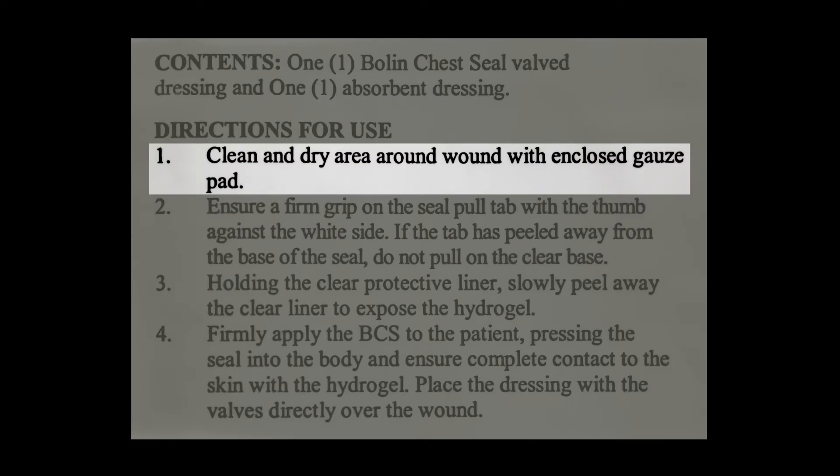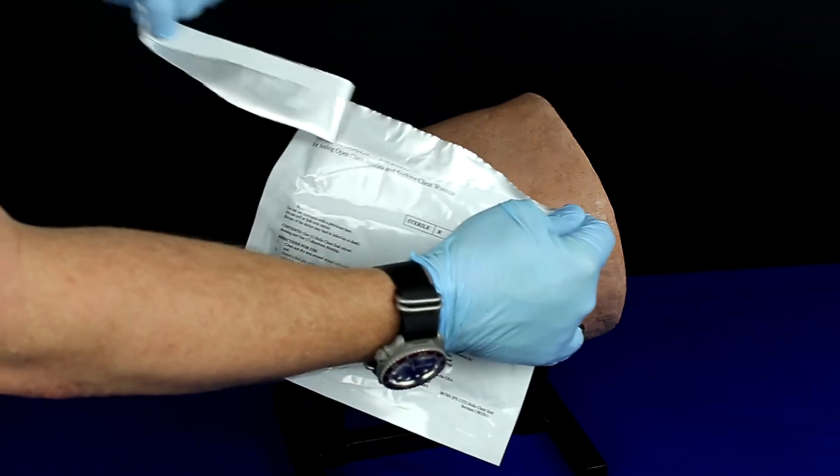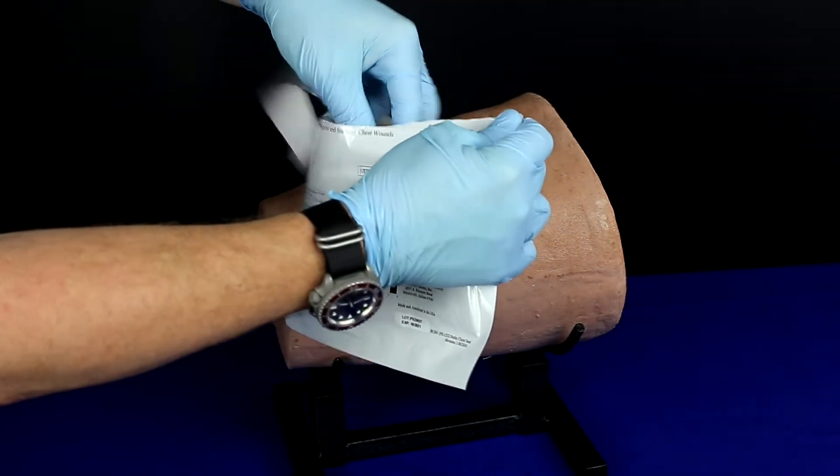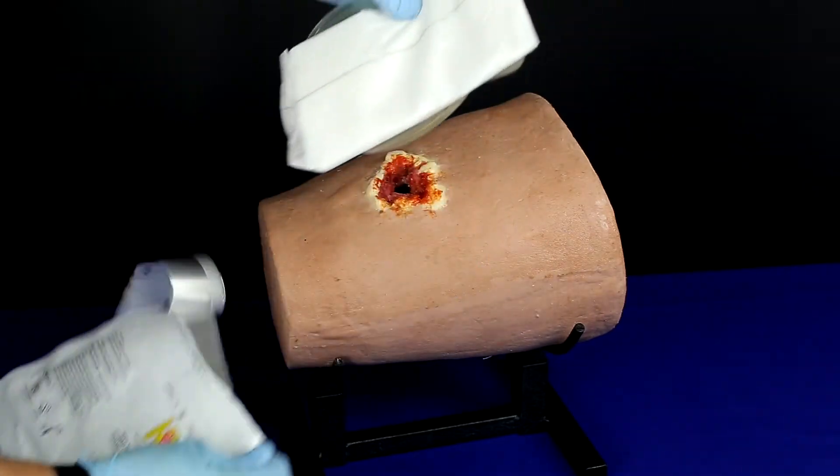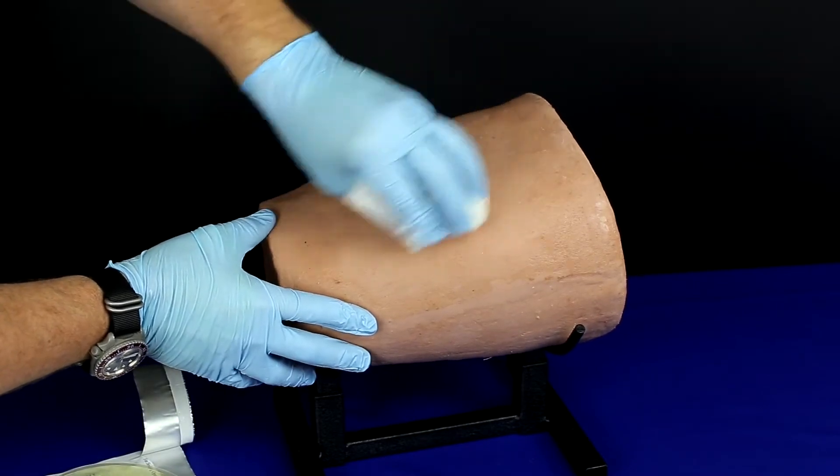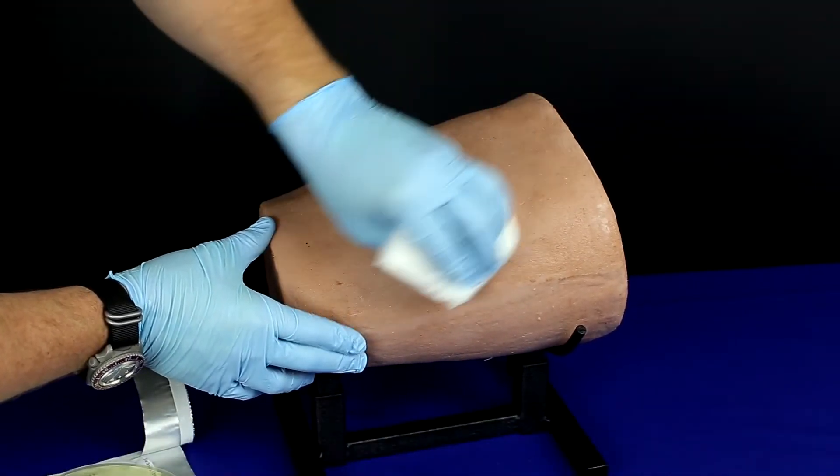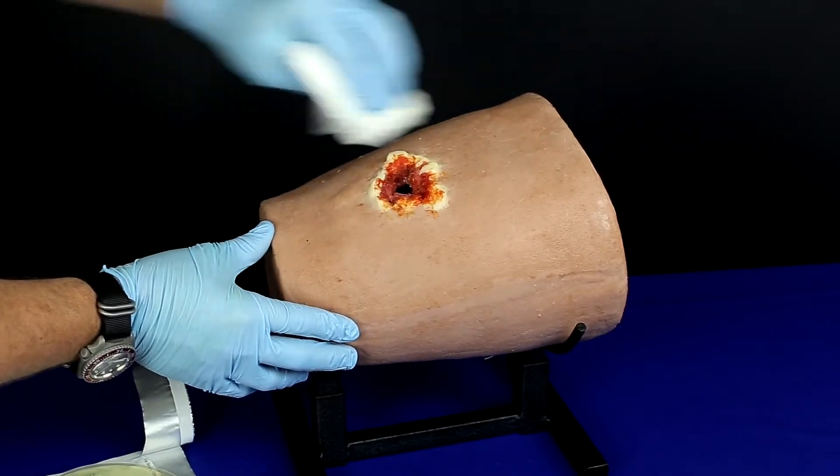Clean and dry the area around the wound with the enclosed gauze pad. Utilizing the tear notches at the top of the packaging, open the package and remove the enclosed gauze. Clean around the wound area, removing any fluids and external debris. Clean in a circular motion moving away from the wound site, keeping in mind that the Bolin chest seal is 6 inches in diameter.